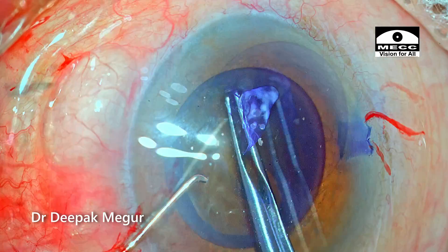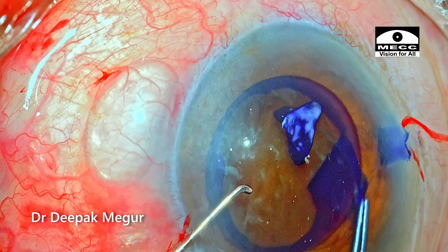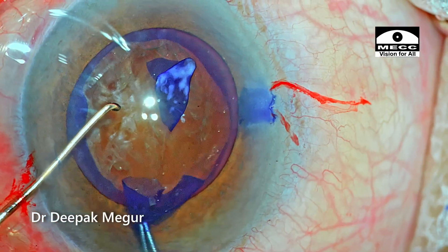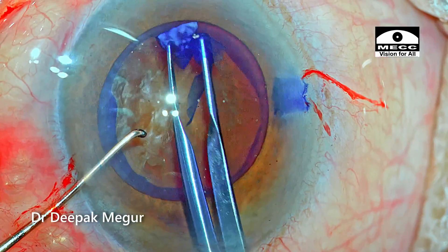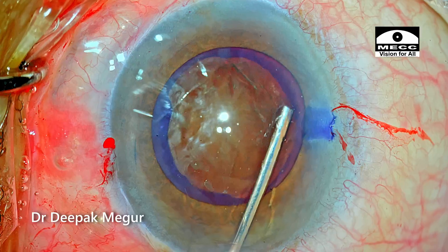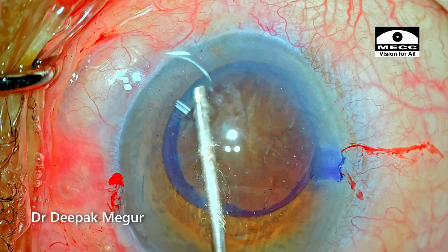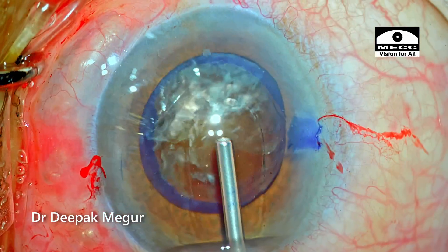Thankfully, the difficult part of the rhexis was uneventful. I'm consciously attempting a slightly bigger rhexis of about 5 to 5.5 mm so that the nucleus division process during emulsification will be less stressful on the rhexis margin as well as on the bag. Gentle hydrodissection using very little fluid is performed, and quick decompression ensures the fluid is let off. I'm confirming the mobility and rotation of the nucleus.